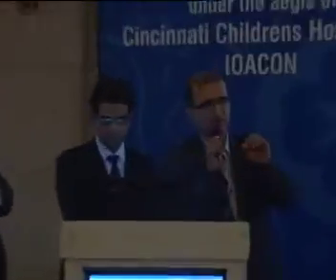I have shown you the spondylolisthesis in an old man with foot drop. Then I did a transsacral fibular fixation. He has been doing well. And in others, I have shown you the reduced and fixed from behind. But if you can reduce it, it's better to reduce always. But if not possible or there are other constraints, then you can do an in situ fixation.